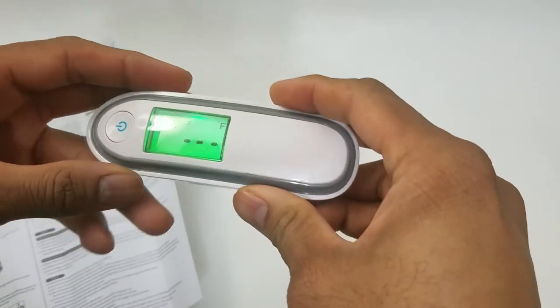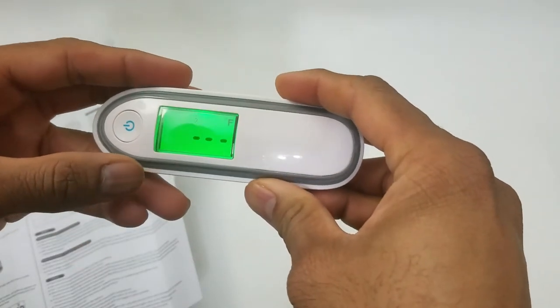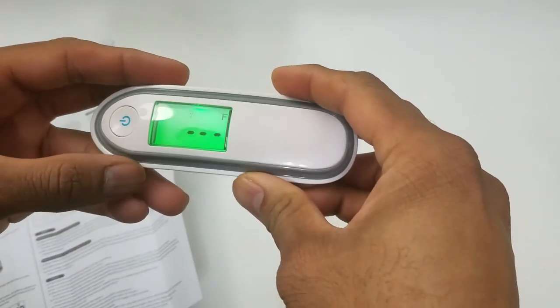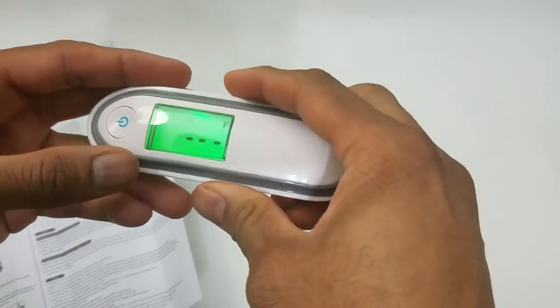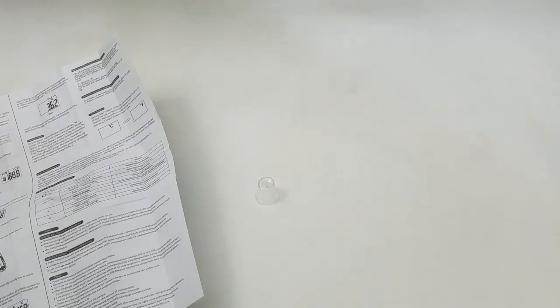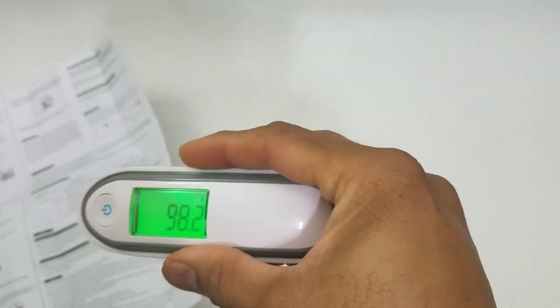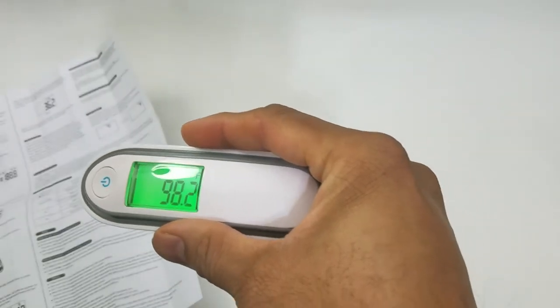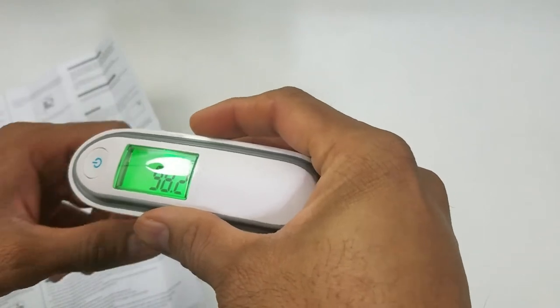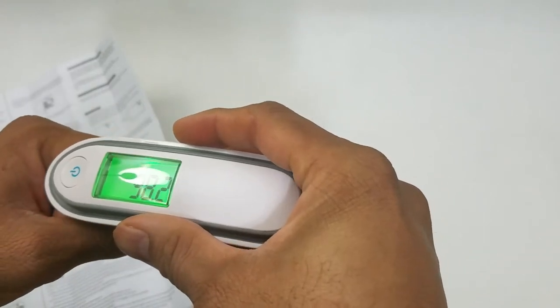Alright, got some fresh batteries in it. As you can see, the low battery indicator is not there. And right on the back, it instantly picks up my temperature.